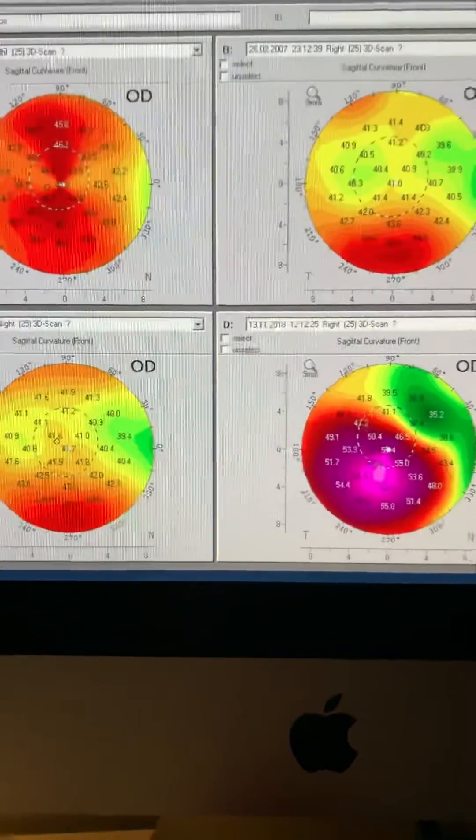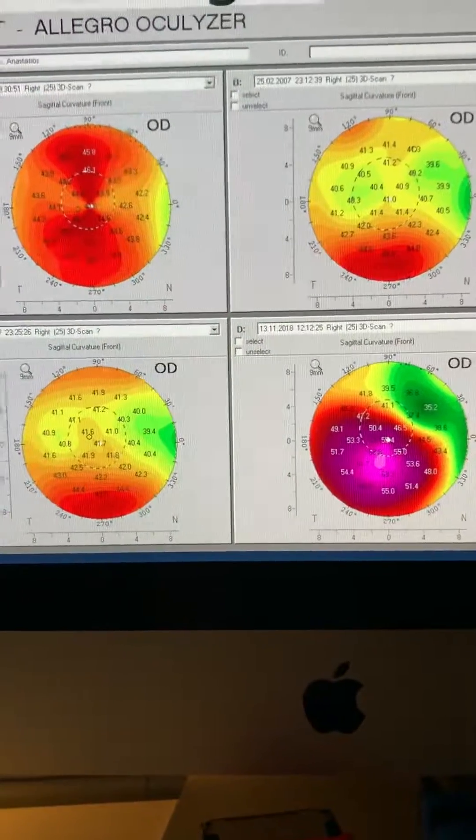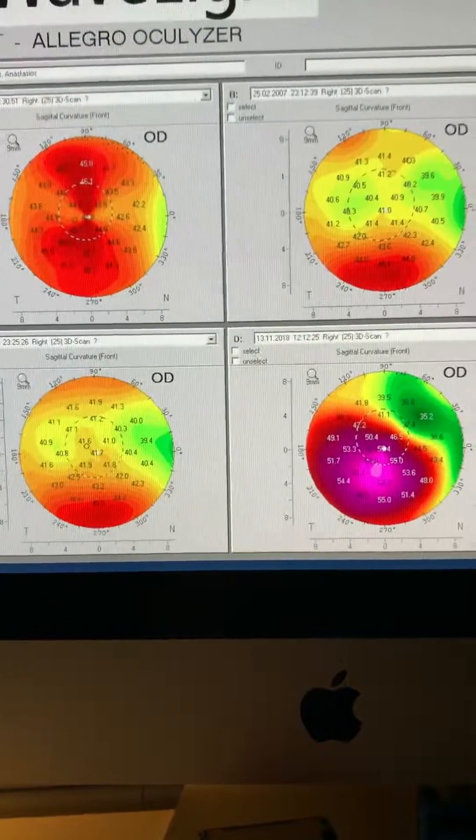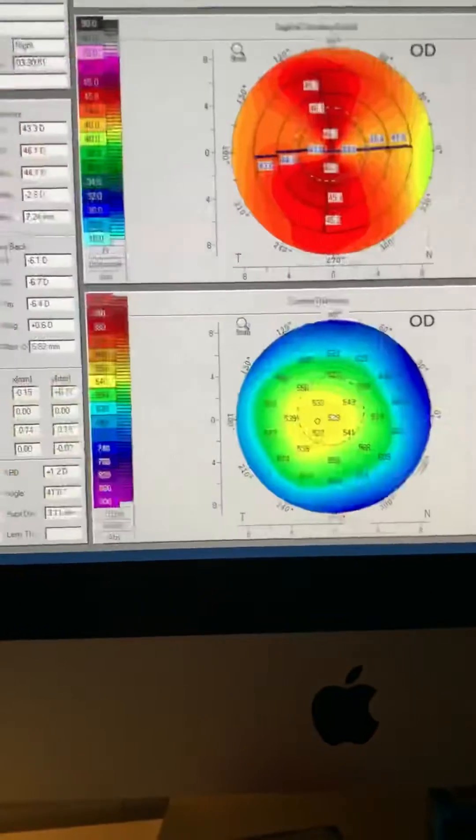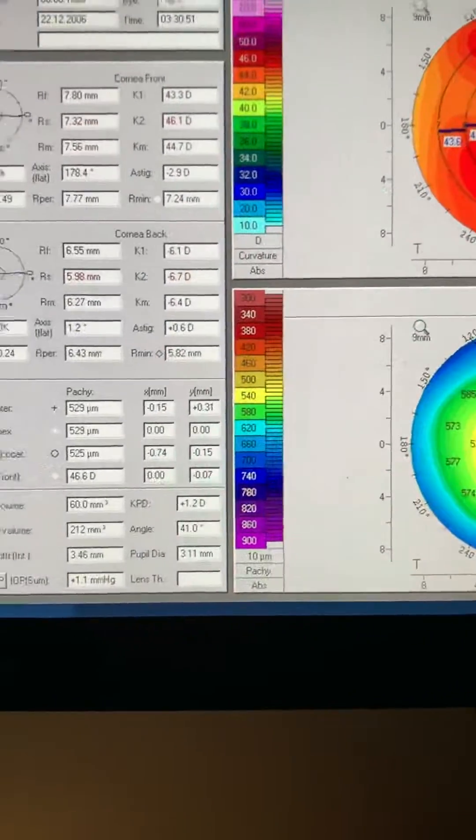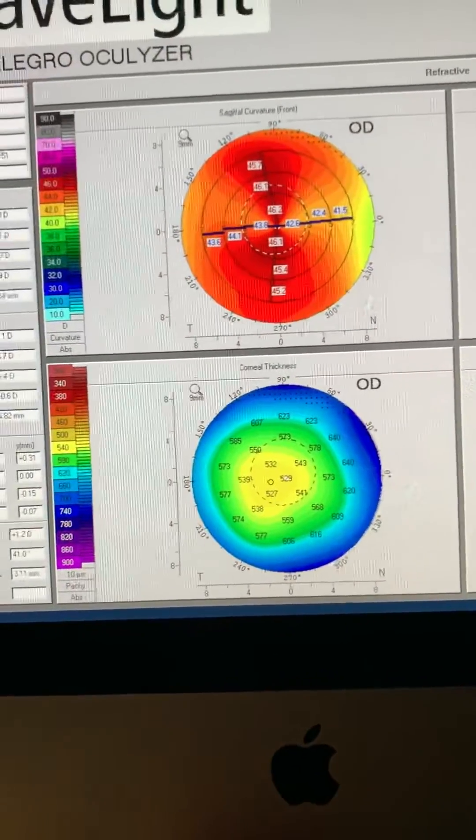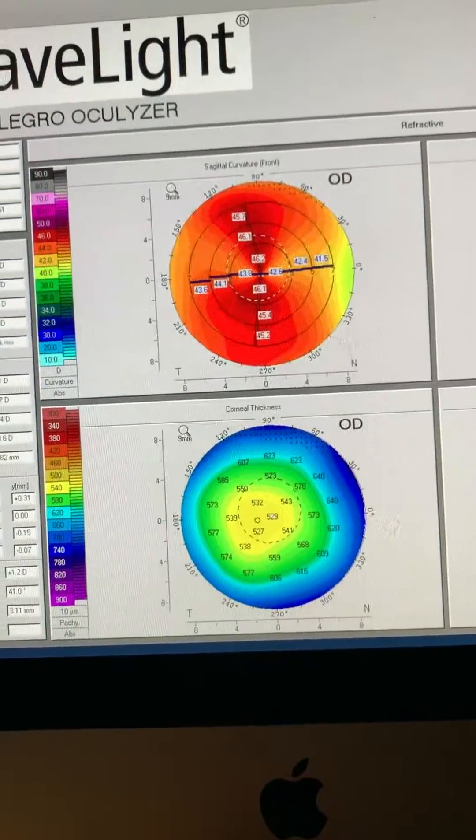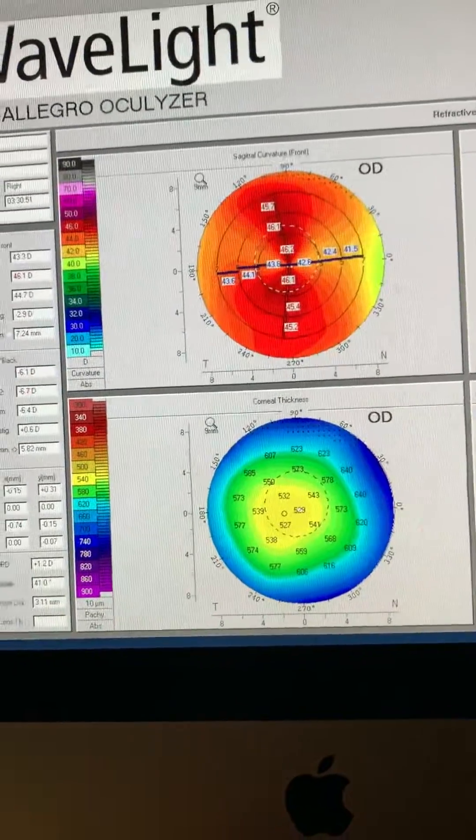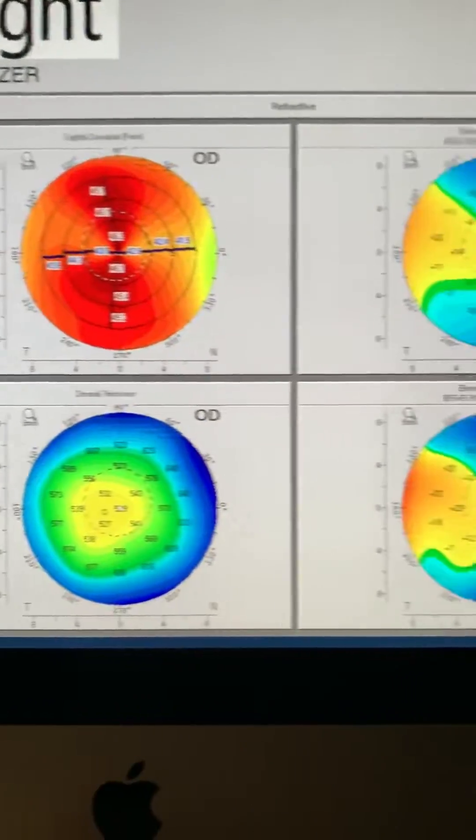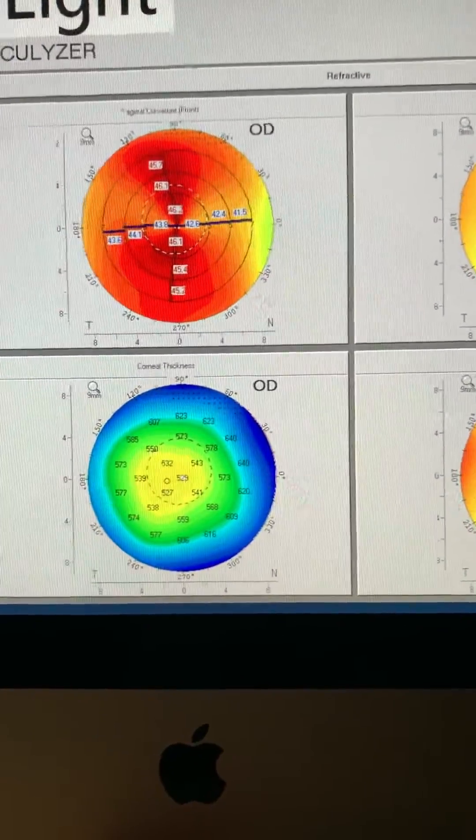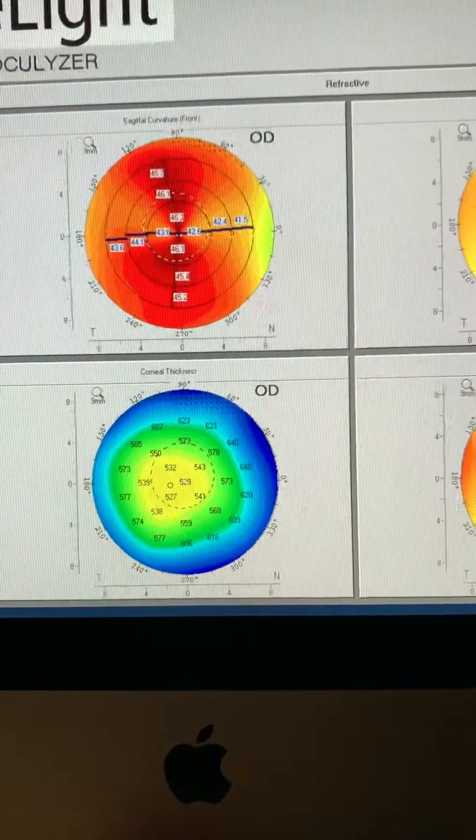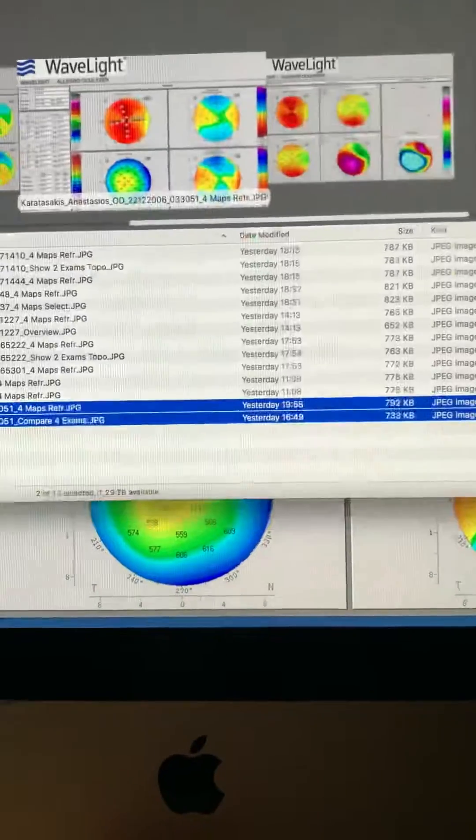An example where no predisposing factor for ectasia took place. We're going to go back and look at the pachymetry maps preoperatively. They were 525 minimum, so the residual stromal bed on this patient was measured to be 400 microns, thus making this a very low-risk patient for ectasia, but nevertheless developed ectasia.